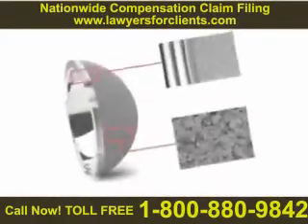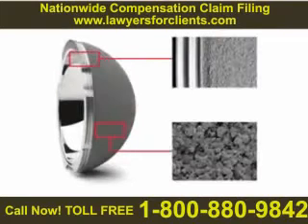The Durom cup is meant to bond to the patient's bone. The outside shell of the cup is porous and has been sprayed with a highly engineered substance that allows the cup to be accepted by the human body and promotes the patient's own bone to grow into the shell. This bone ingrowth into the porous shell is what is intended to hold the cup in place.